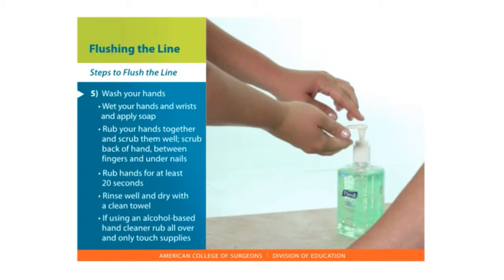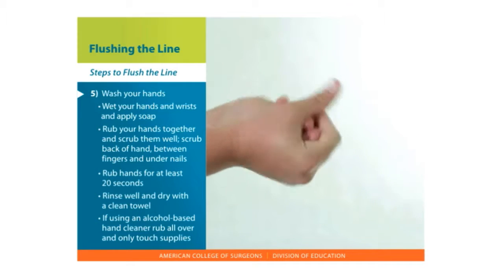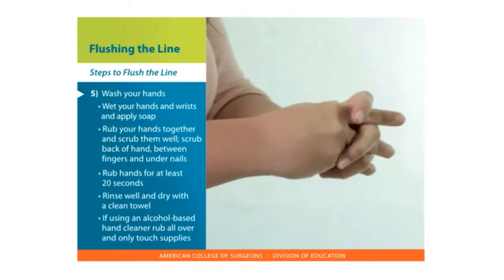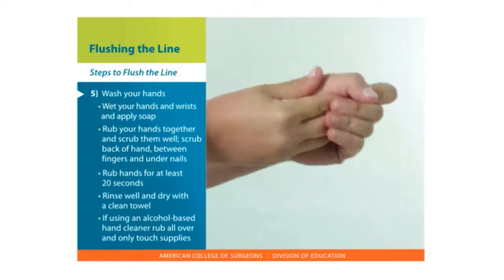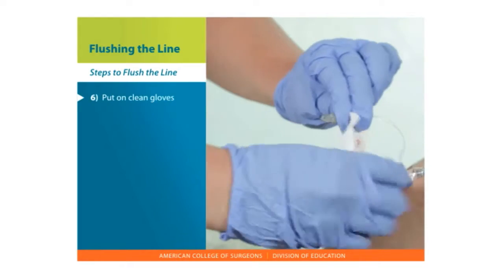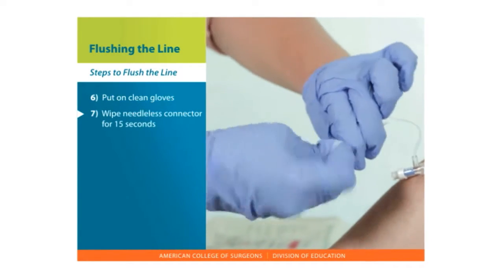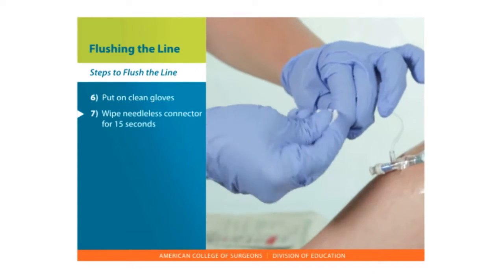There are some times when you may be using an alcohol-based hand cleaner instead. Be sure to rub the cleaner over all surfaces of your hands and fingers until your hands are dry. Don't touch anything other than your supplies after you clean your hands. Put on clean gloves. Wipe the needleless connector with your cleaning solution, alcohol, or CHG wipe, for 15 seconds.